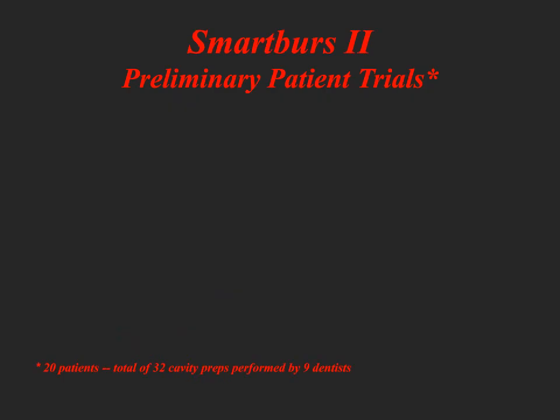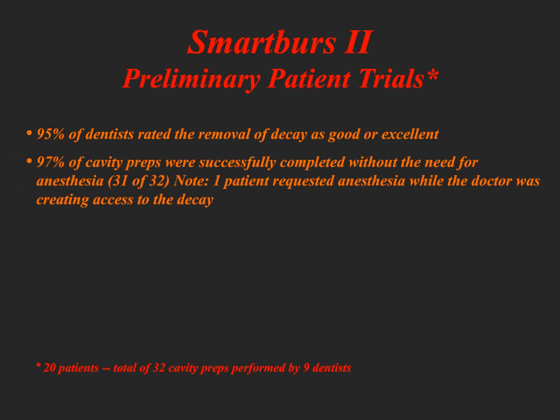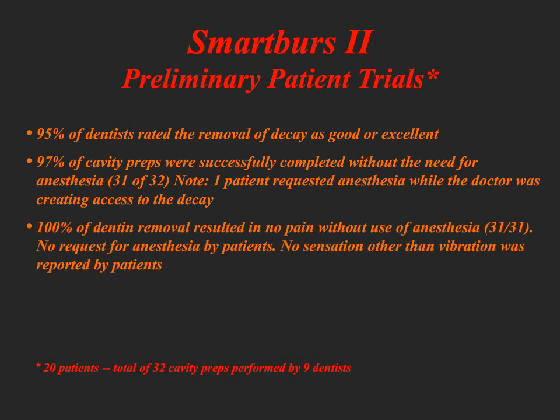Patient trials have been done using SmartBurs II. 95% of these dentists rated the removal of decay as good or excellent. 97% of the cavity preparations were successfully completed without the need for anesthesia. 100% of the dentin removal resulted in no pain without the use of anesthesia. This is big, because if you can do this for a patient and not give them a shot, that takes away one of the barriers of patients getting treatment.